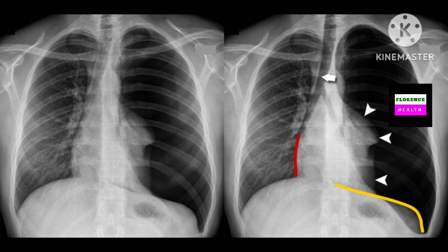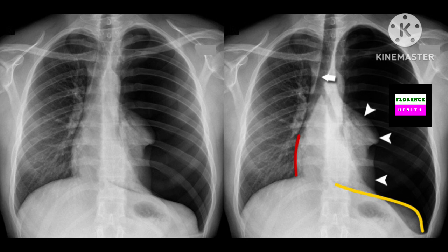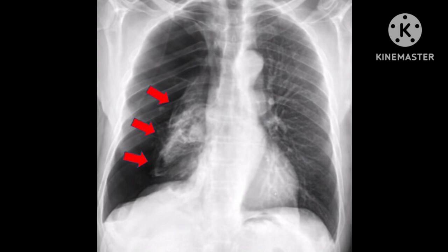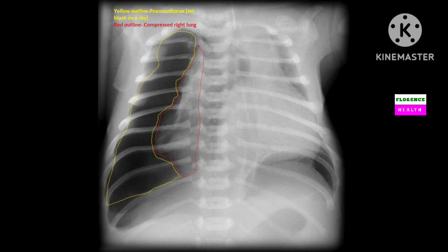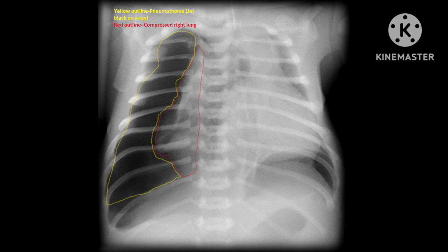Another finding is a decreased size of the left lung — that is, collapsed left lung with left side pneumothorax. This slide shows the right side of the chest is more black in comparison to the left, with loss of its bronchovascular markings and decreased size of the right lung — that is, collapsed right lung with right side pneumothorax. Another slide also shows the right side more black with loss of bronchovascular markings and decreased grayish border of the right lung, consistent with right side pneumothorax.